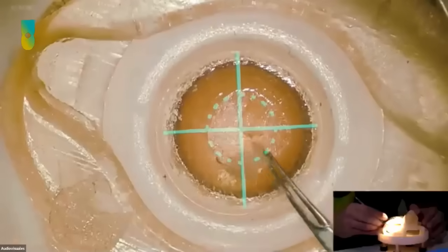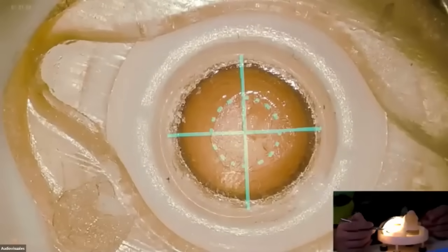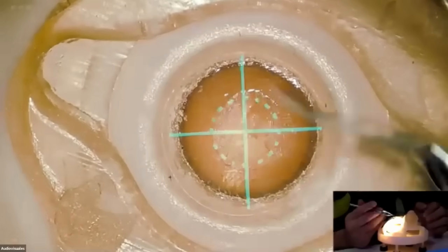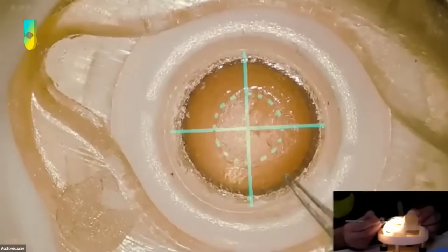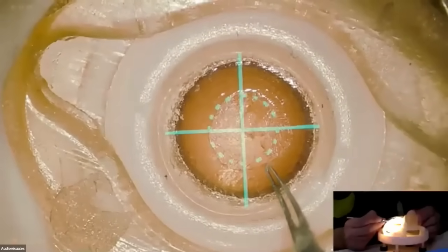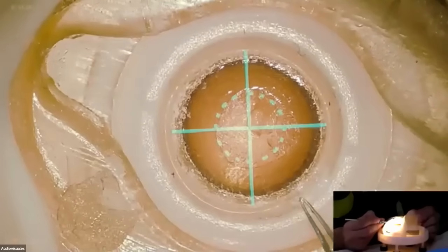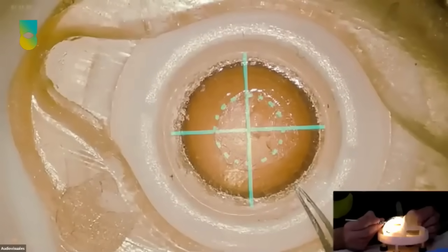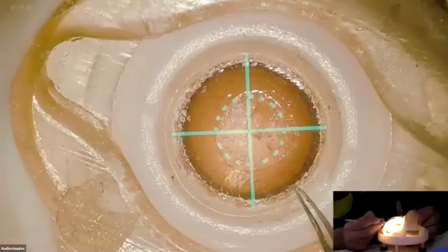Yeah, I love this. We have this available at Cornell where I teach, and it's really important because as you're learning cataract surgery, visually it can be very deceiving by how dilated the pupil is, by how big you should make your capsulorhexis. And we know the capsulorhexis should be around 5 millimeters or so. And if somebody's really widely dilated, you might actually make it bigger than you anticipate. And if they're not as well dilated, you might make your rhexis smaller than you anticipate. So using this overlay can be extremely beneficial. If you don't have access to this technology, because not everybody does, you can see on these forceps here, there's actually a marker on them.